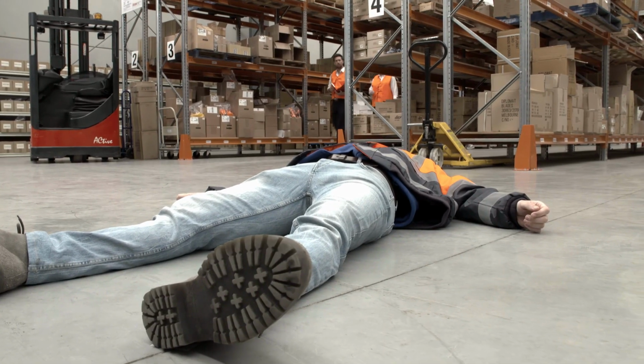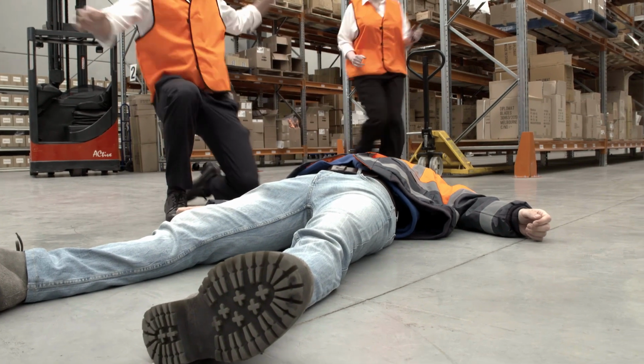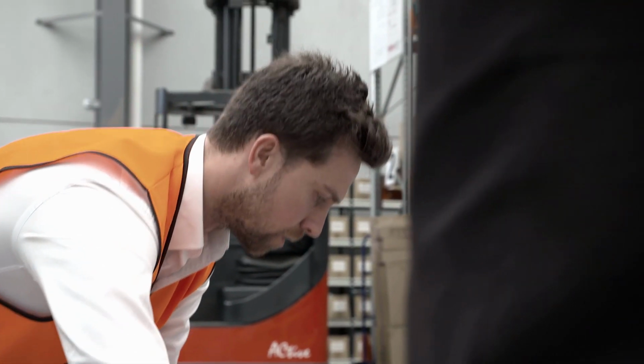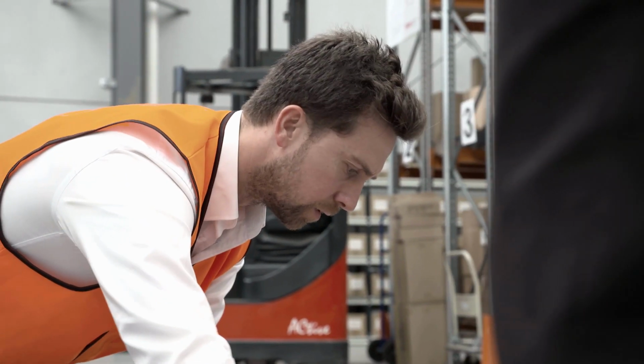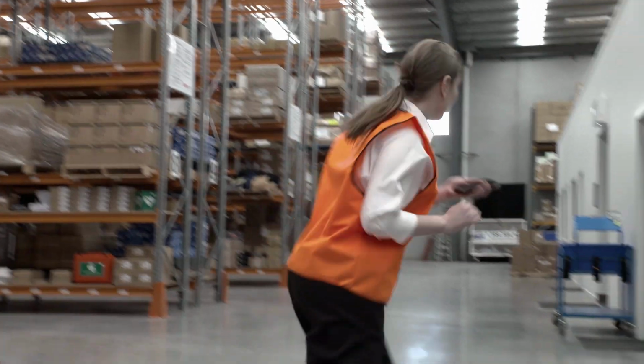Just go back into the side. James! James! James, are you okay? Check the patient's response to talk and touch. James. Touch or tap on the patient's cheek and ask if they are okay. James, are you okay? If no response, call 000 ambulance. Beth, call 000 and get the defib.